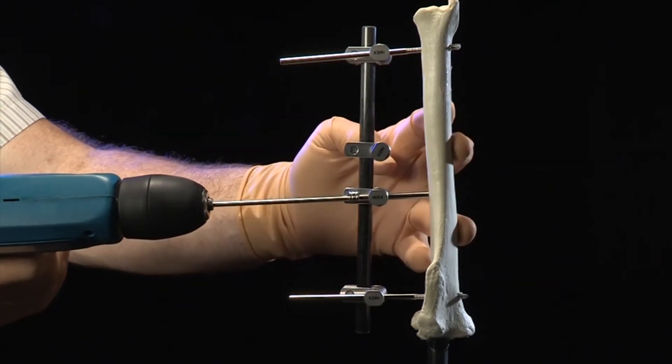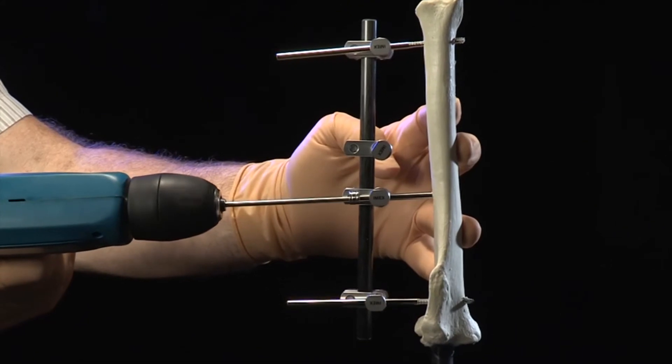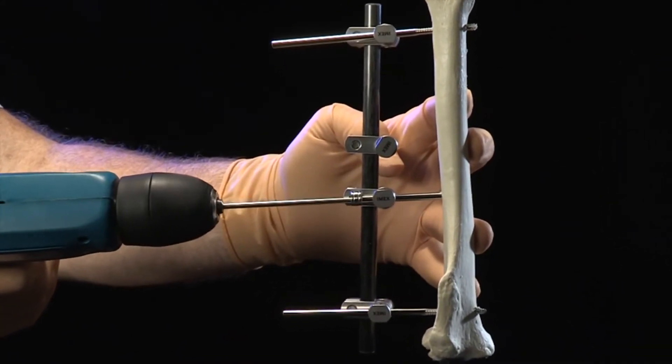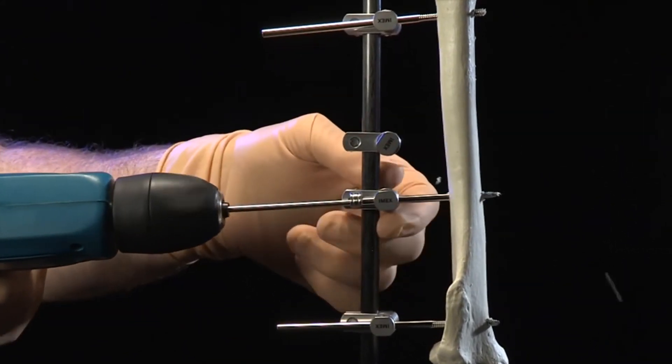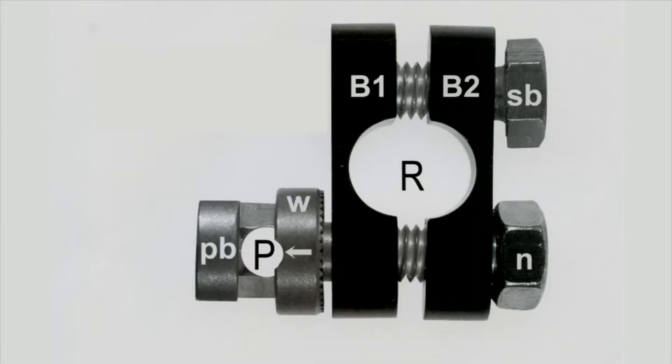The hole in the primary bolt is large enough to accommodate sleeved pre-drilling and application of positive profile or DuraFace pins directly through the bolt, while allowing the surgeon to pre-place a desired number of clamps on the external rod prior to pin application. The rod gripping channel labeled R is in the center of the clamp.